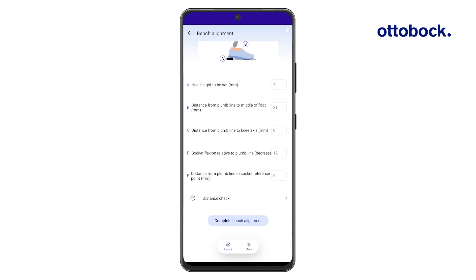The alignment recommendation represents a starting point that must be further optimized together with the user.